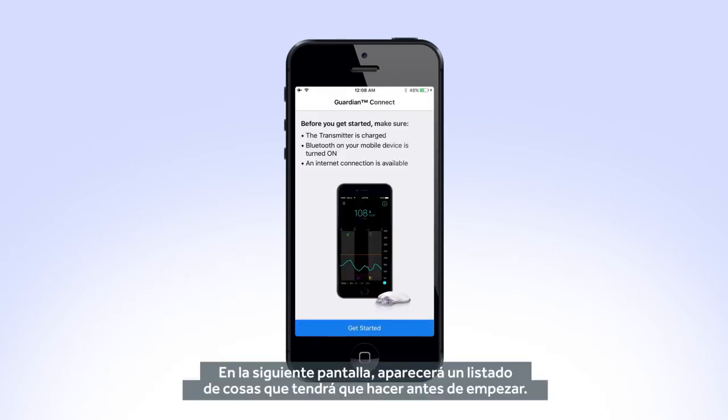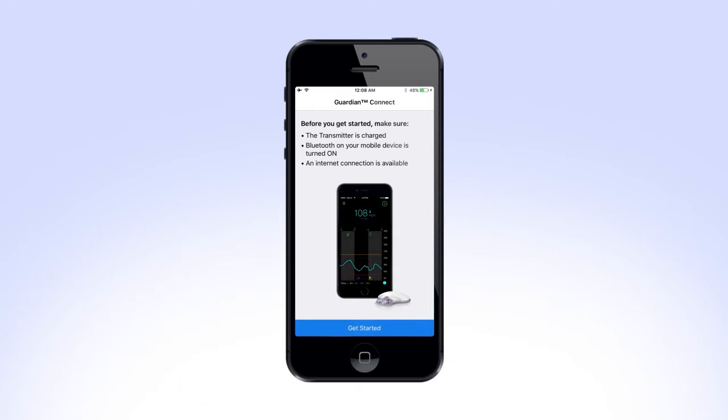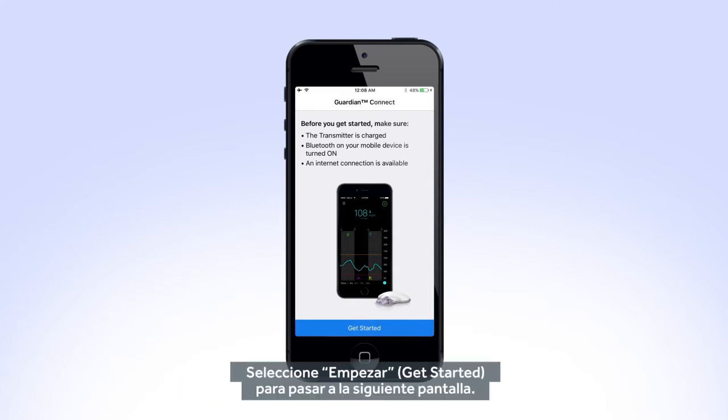On the next screen, you will see a list of things that you will need to do before you can get started. Select Get Started to move to the next screen.